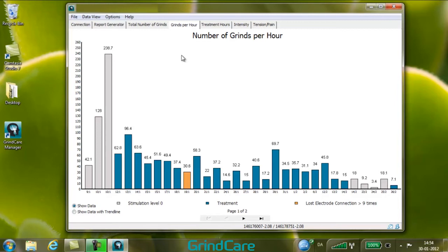On the screen, a number of bars are shown, each corresponding to one night of treatment. Clicking on any individual bar in the bar chart opens a small window displaying treatment session details. Clicking on a specific bar using the right mouse button allows you to delete that bar. The grey colour indicates that the stimulation level was set to zero — this is a baseline measurement. The blue colour indicates a treatment session with a stimulation level of one or higher.